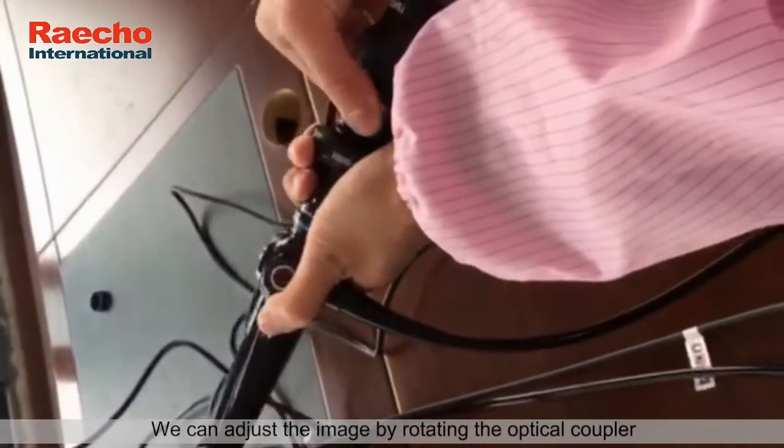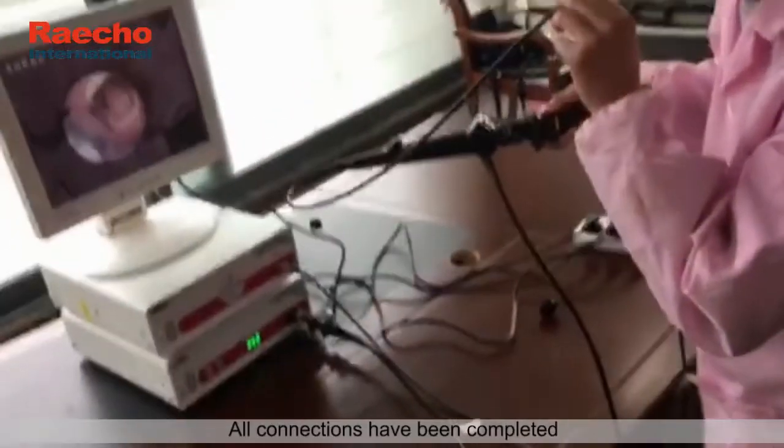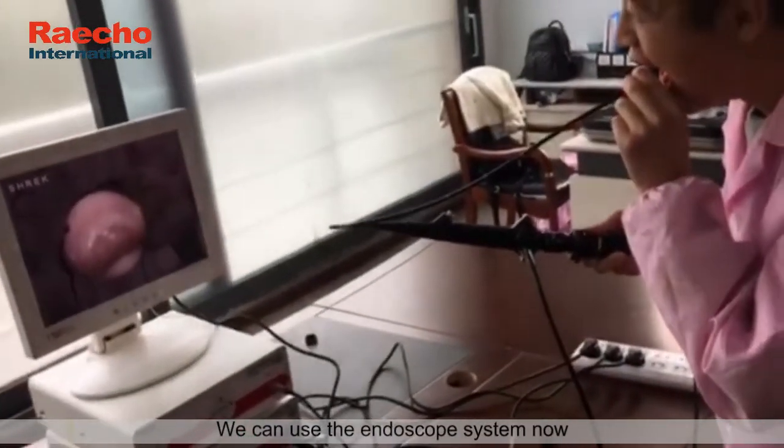We can adjust the image by rotating the optical coupler. All connections have been completed — we can use the endoscope system now.